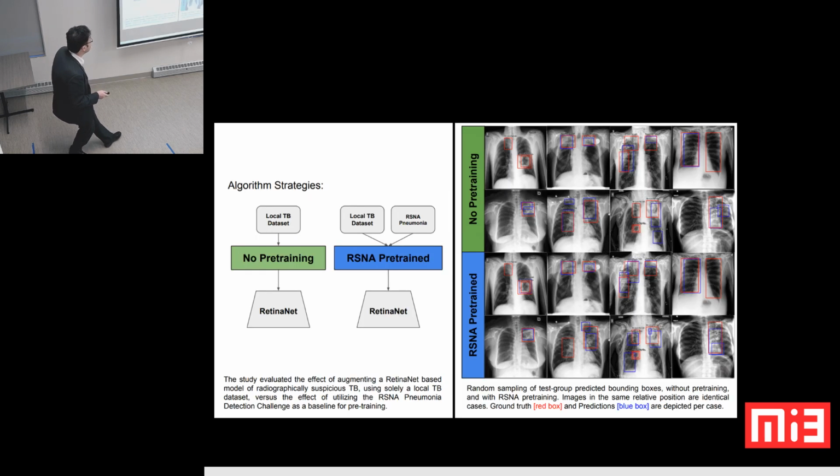The technology is getting to a point now where we're even able to leverage existing information from a public competition data set, pre-train a network, customize it locally on McGill information, and do almost like location and localization propositions as well. So this is done on our local MUHC data sets.